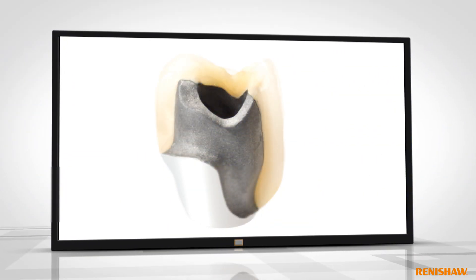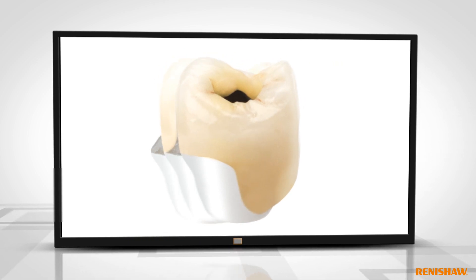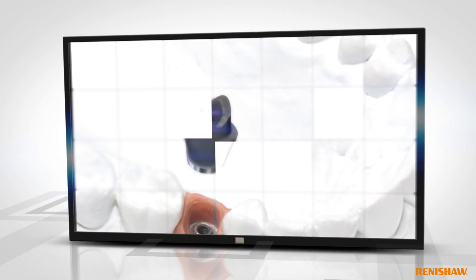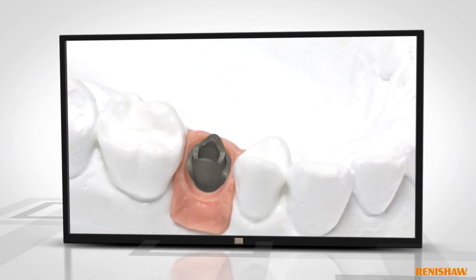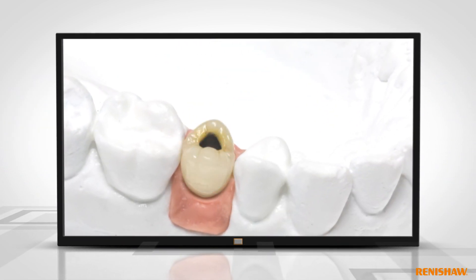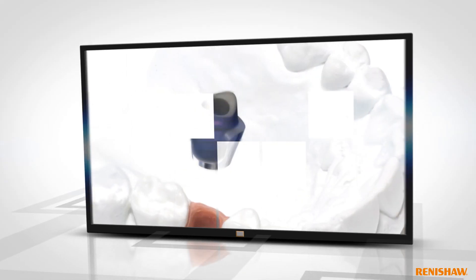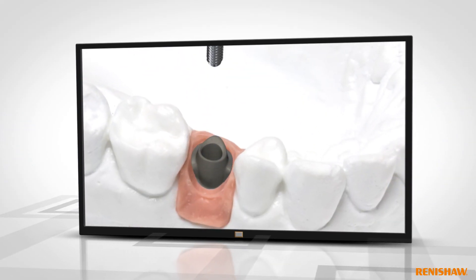Standard porcelains can be easily bonded to the surface, making the abutments ideal for screw retained crowns. Custom abutments are also available.